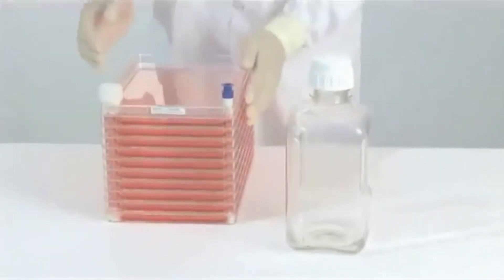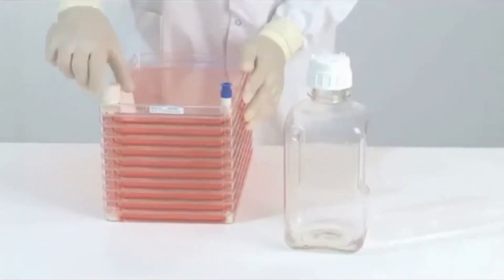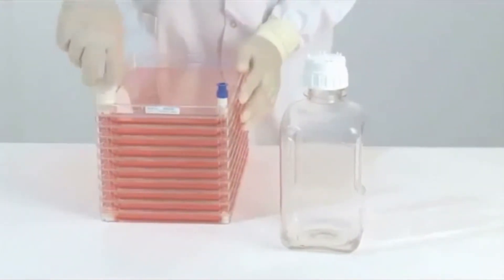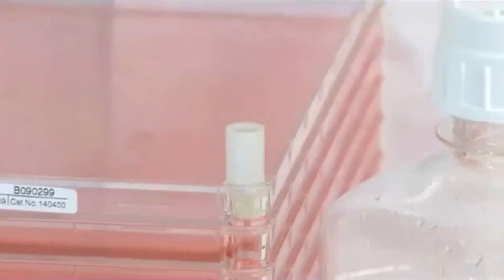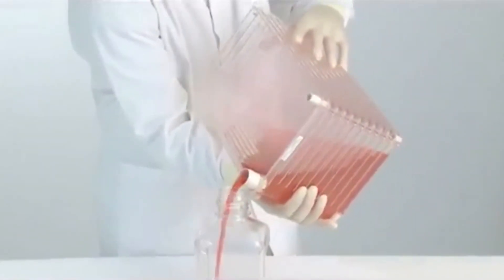To empty the EasyFill Cell Factory System through the wider port, remove both the white vent cap and the blue cover cap. Then simply pour the medium into the bottle.